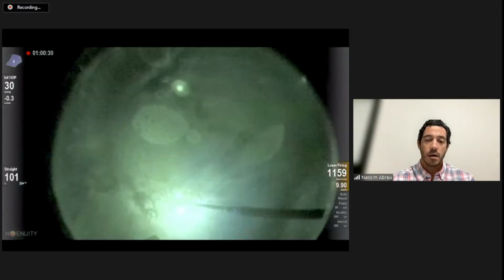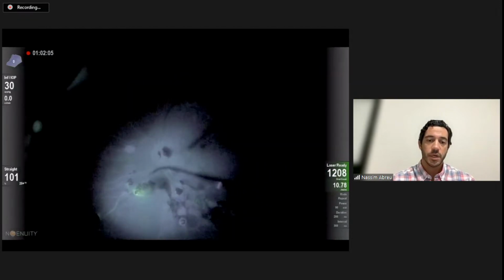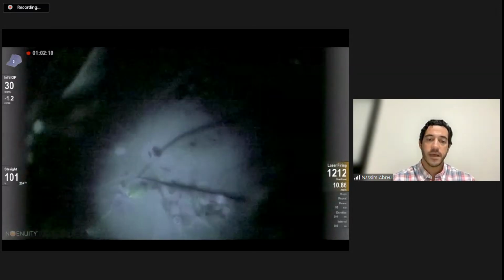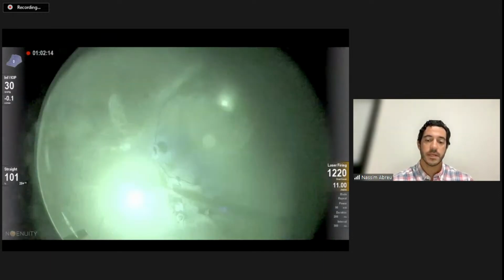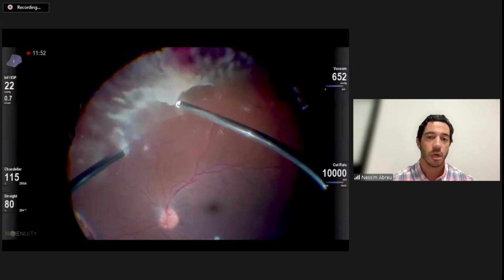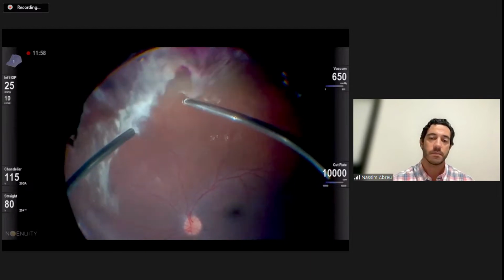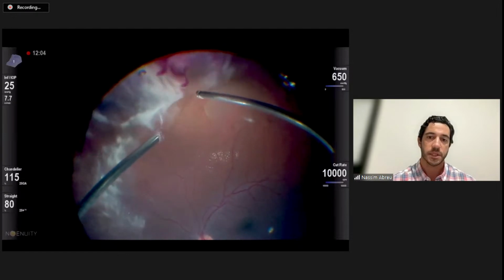And here, we VR surgeons who treat severe PDR know that at some point we're going to encounter neovascularization where you get blood clots over the neovascularization. We cannot see if it's actually leaking or not. Well, with intraop FA, we can see that it leaks under it, and we can assure that we need to definitely either remove the blood and treat, or do photocoagulation over it until it stops leaking.